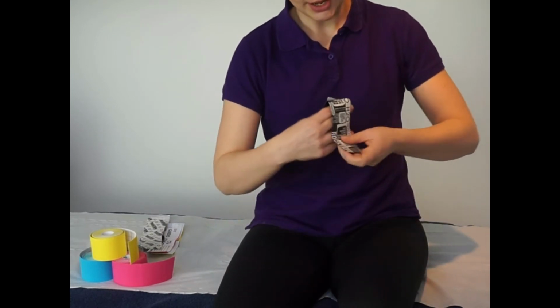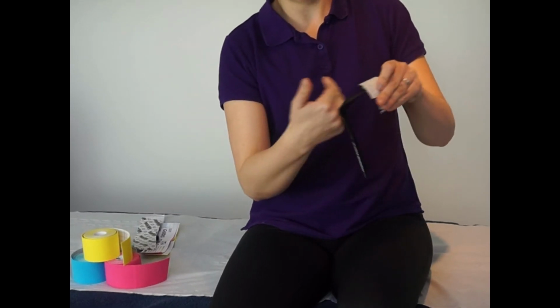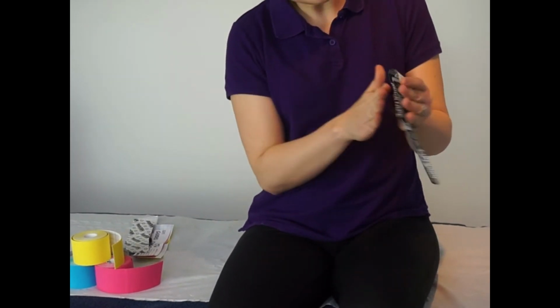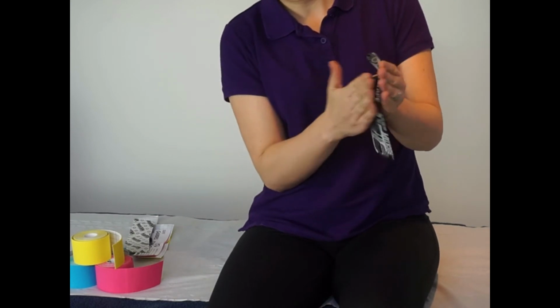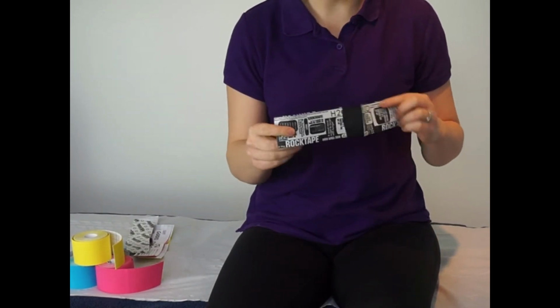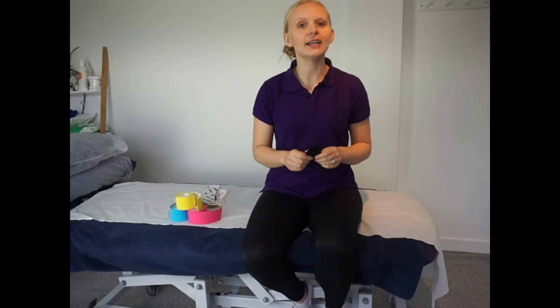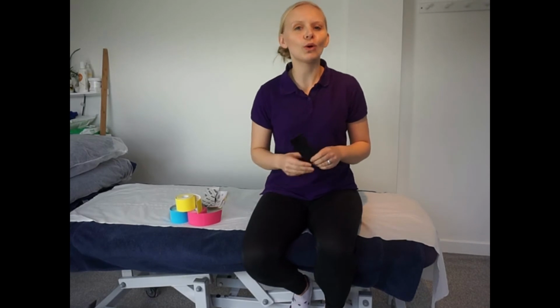So if I pull the tissue away from the tape and then have a bit of a feel of the stickiness, can you see the difference? So if I'm using my fingers, again it's a lot more sticky. So there is a difference in this type of tape. So it is important when you're choosing the tape for your clients to make sure that it's going to last as long as you want it to.